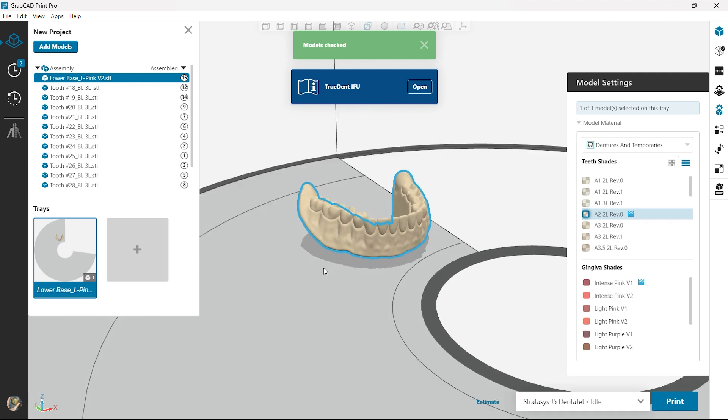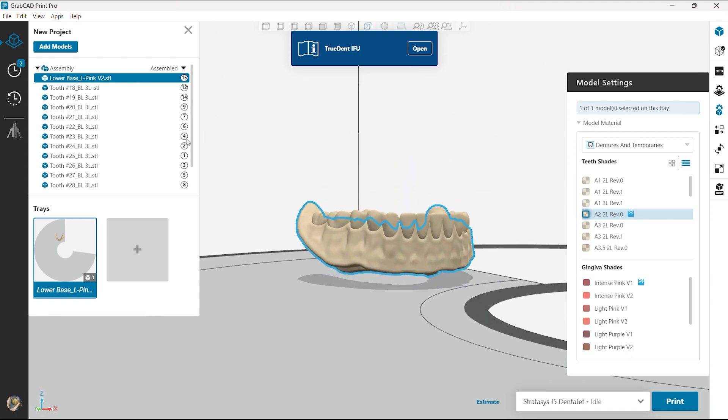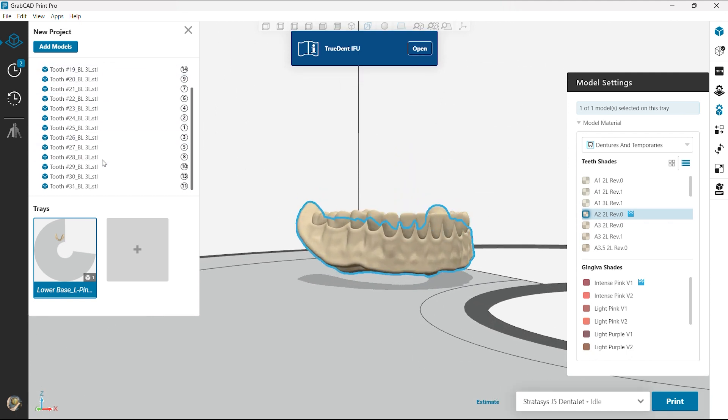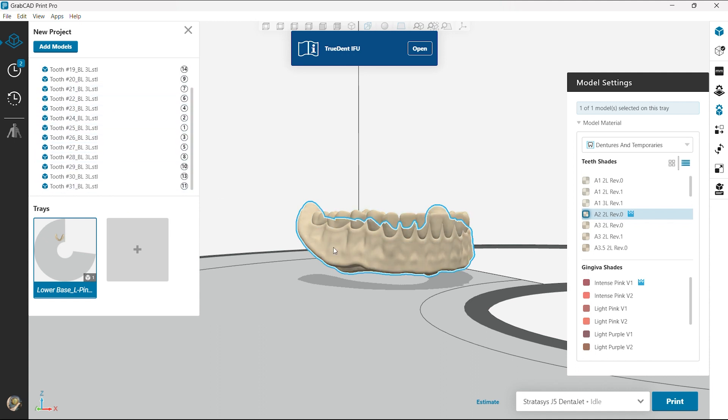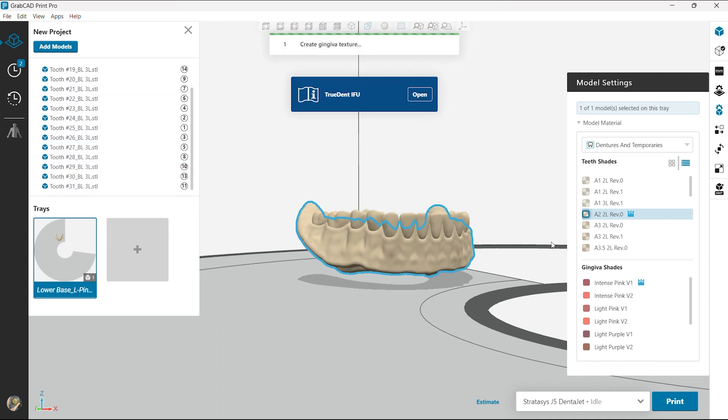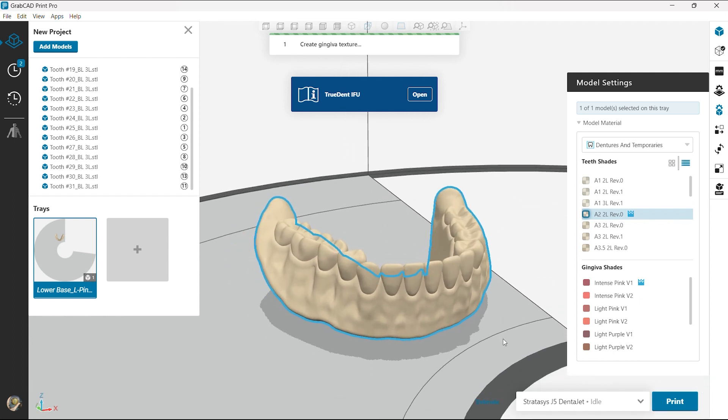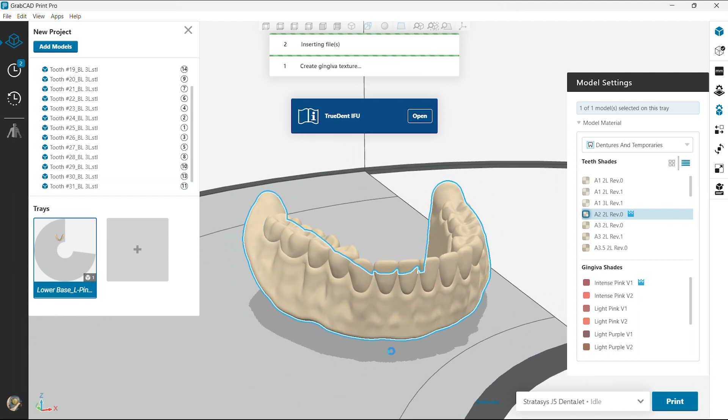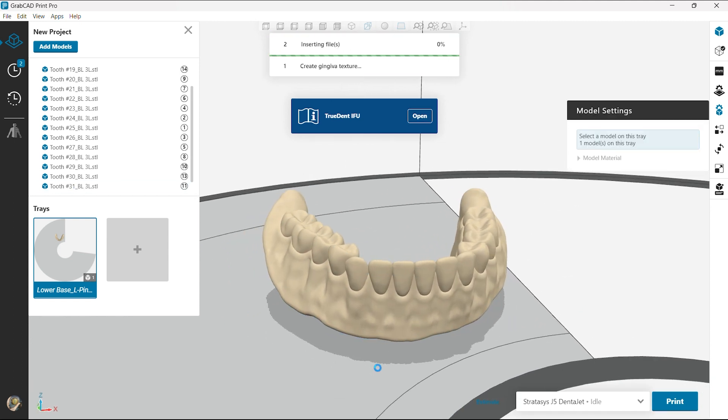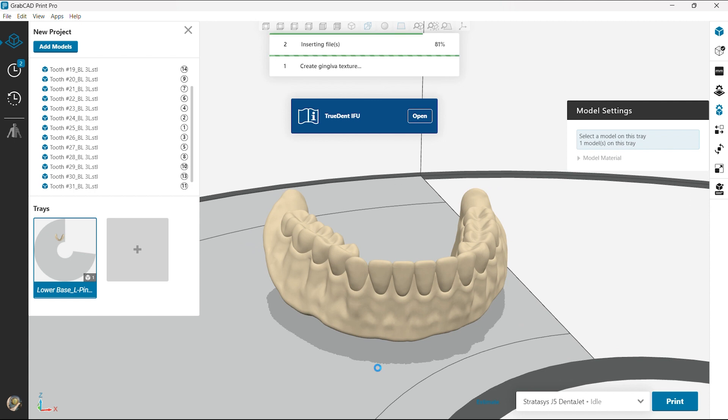For here I'm gonna change the gingiva color to a light pink. So it's gonna insert everything. Again it's gonna put the veins, the texture, everything we're looking for for an accurate model or denture. It creates all that texture in the software.